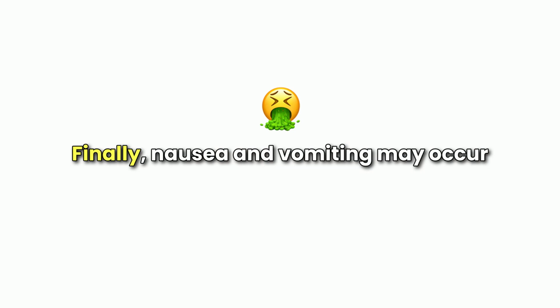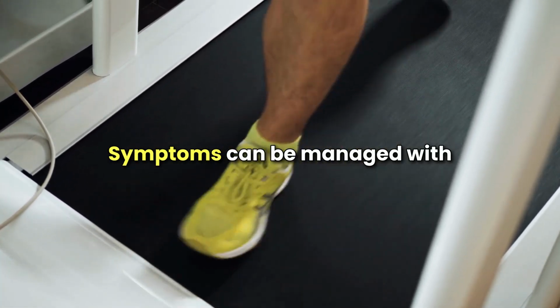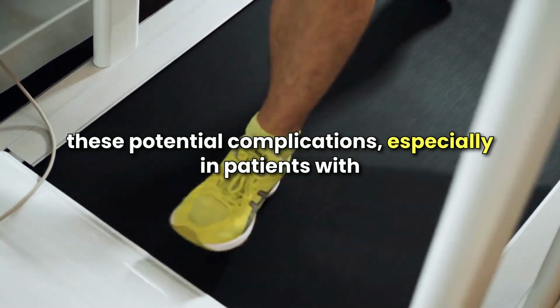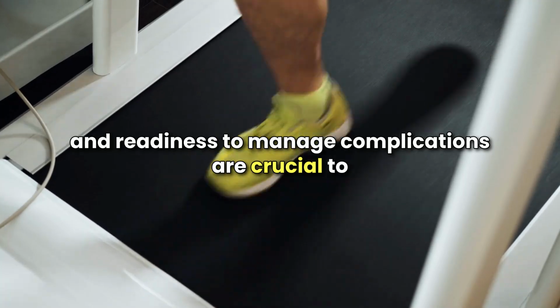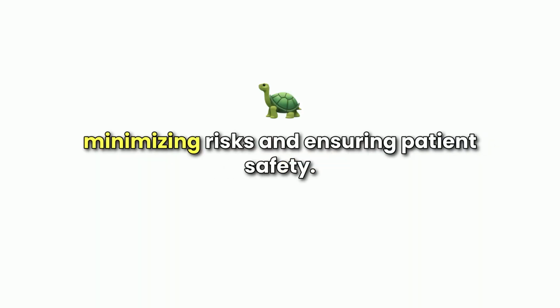Finally, nausea and vomiting may occur due to the systemic effects of dobutamine, particularly at higher doses. Symptoms can be managed with symptomatic treatment and monitoring. While the dobutamine stress echocardiogram is a powerful diagnostic tool in assessing aortic stenosis, it is essential to be aware of these potential complications, especially in patients with severe or complex cardiac conditions. Careful patient selection, continuous monitoring during the test, and readiness to manage complications are crucial to minimizing risks and ensuring patient safety.